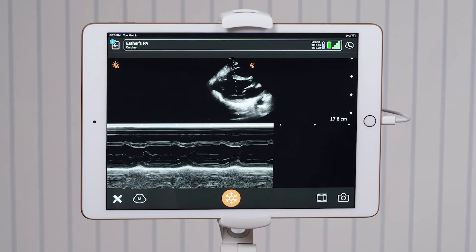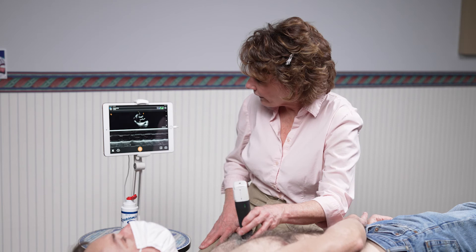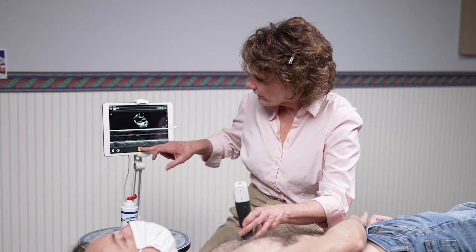Once I've obtained a good tracing of the mitral valve, I'll freeze the image.